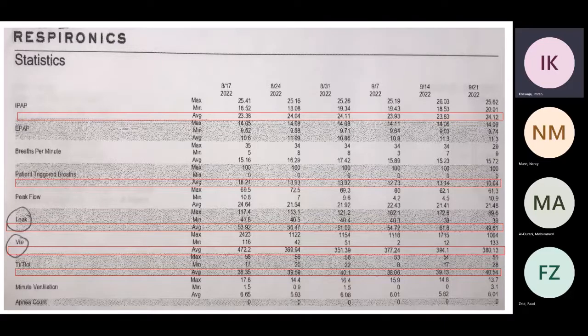Correct, supposedly. Because if they're relying on the machine, 90% of the triggers in here are machine triggered breaths. So this is variable. There is nothing on the machine that you can dial to make the I to E ratio. You cannot. The rate is what you decide, and the patient can breathe more than what you set, but the variable that you need to change is your I time.